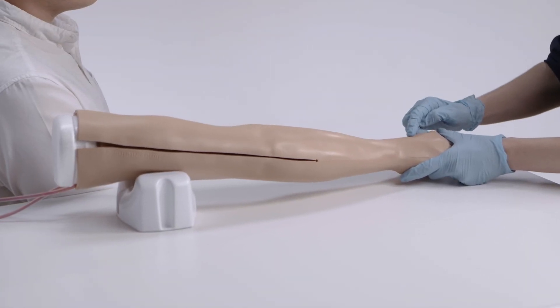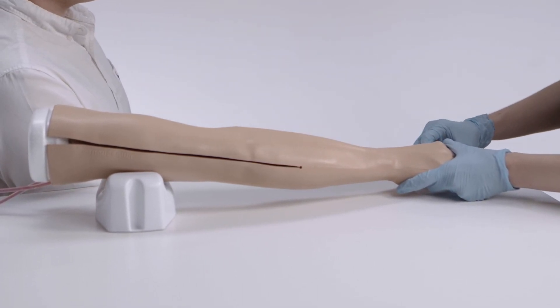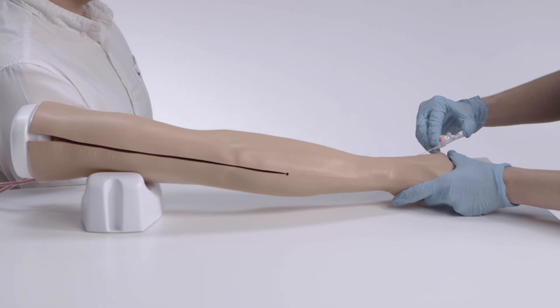The durable models allow for repeated practice lasting up to 500 needle insertions and can be used for tabletop or simulated patient training.